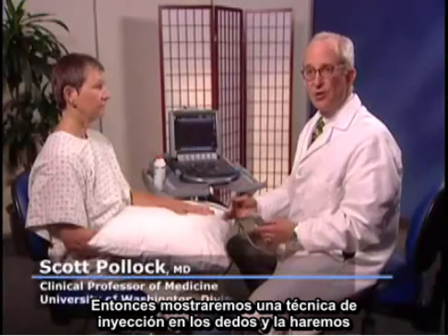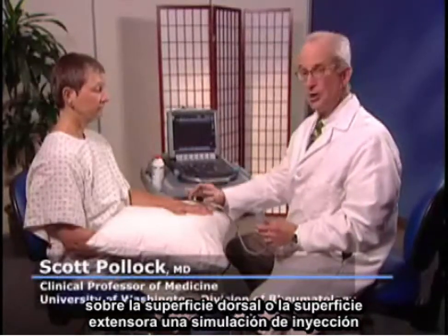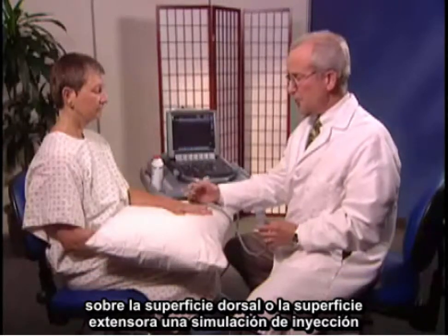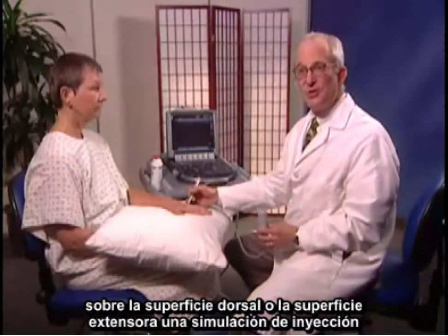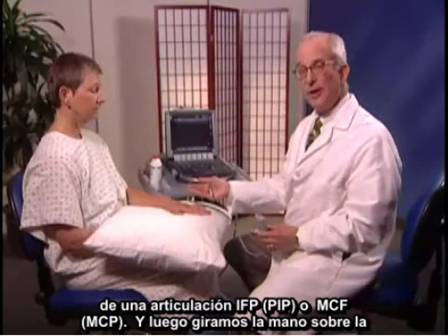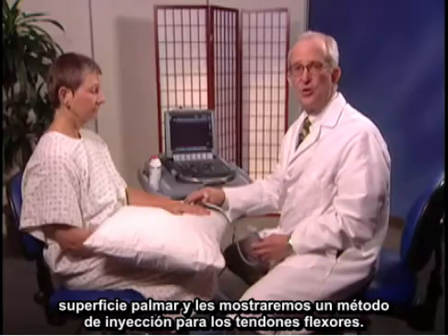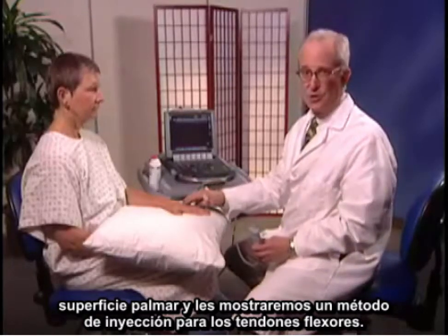I'm going to show a technique for injection of fingers. On the dorsal or extensor surface, we'll do a simulation of injection of either a PIP or MCP joint, and then turn the hand around on the polymer surface and show you an injection approach for flexor tendons.